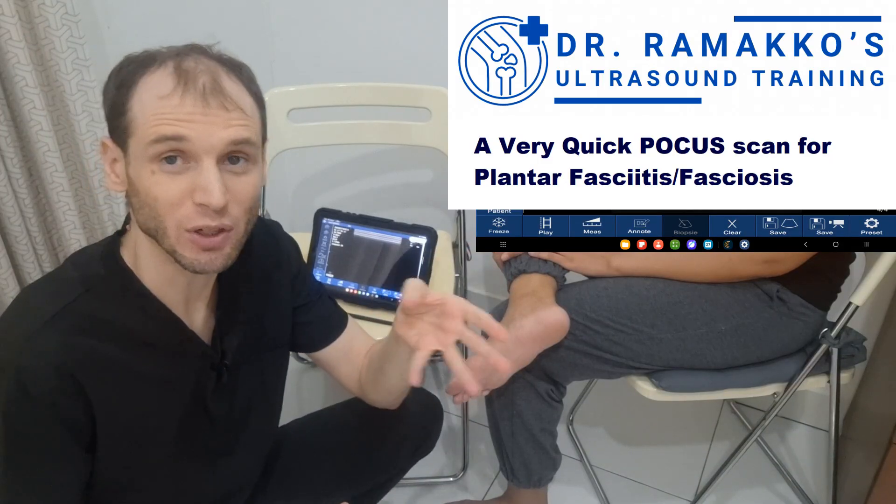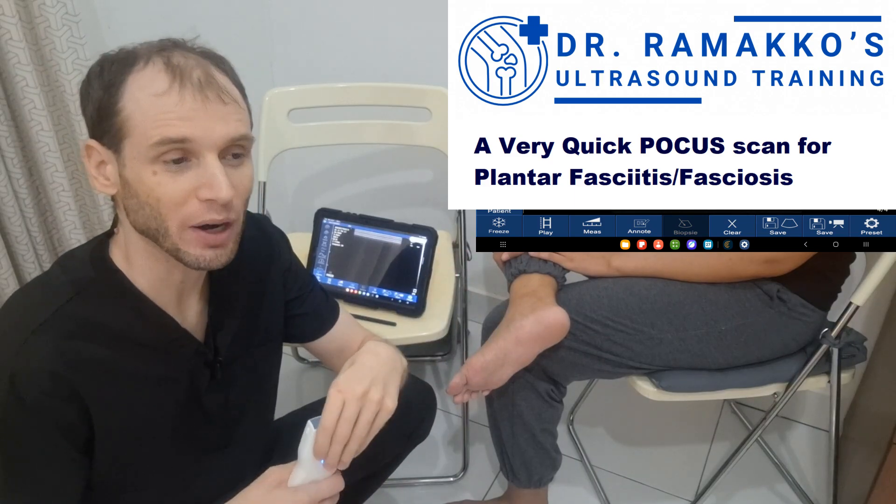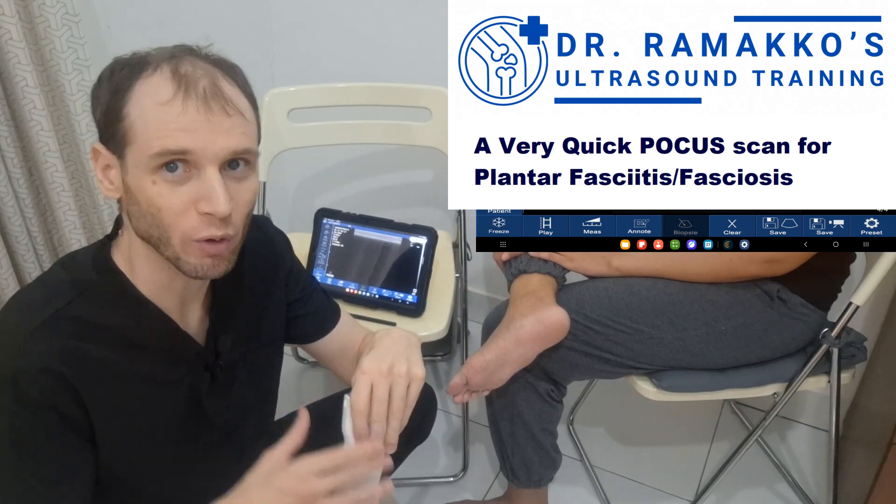Normal is around two or three millimeters and abnormal is like five or six, so it's very rare that you'll find someone right around that four millimeter mark.